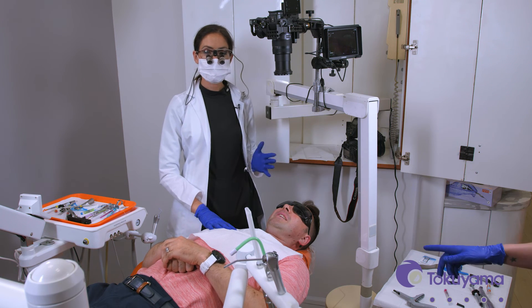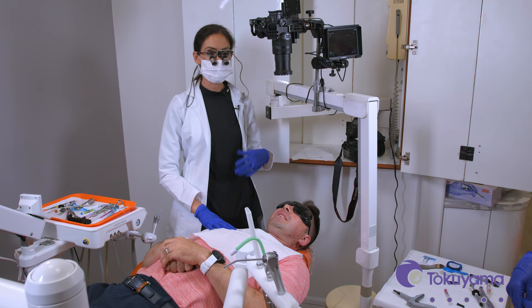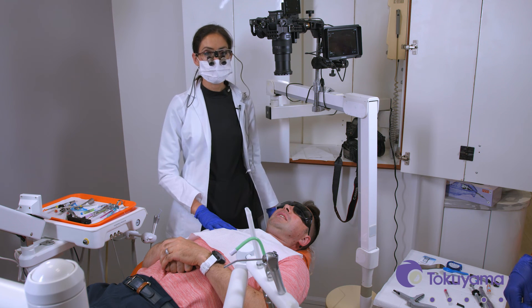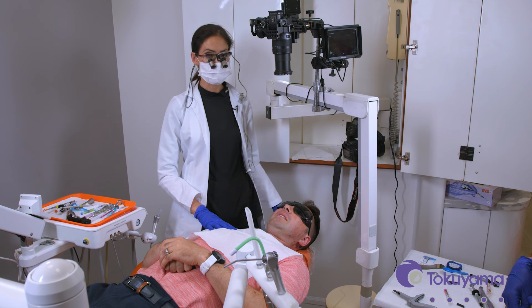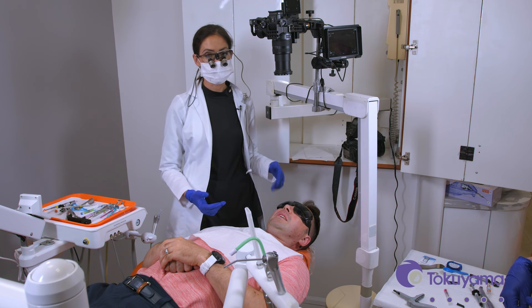So as you can see, that was really simple, even though we were working on a front tooth. It's a really easy product to use, works really great. I'm sure you're going to have really great results — try it yourself, you're definitely going to love it.